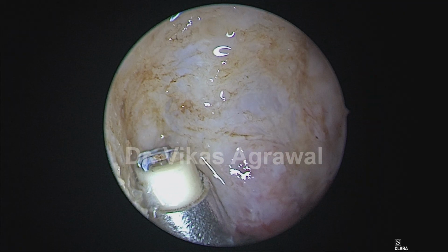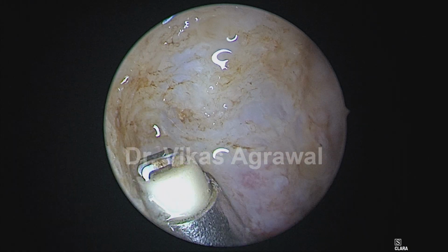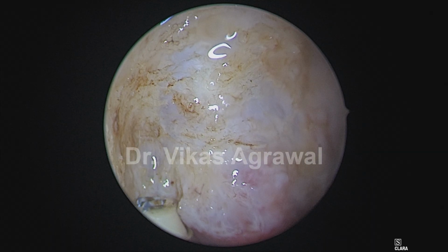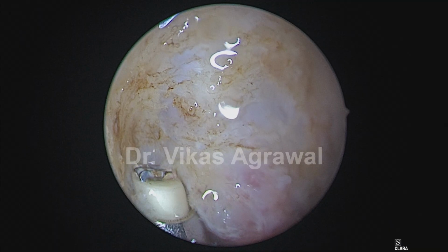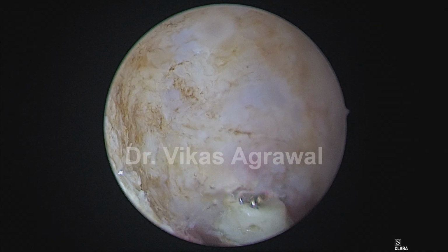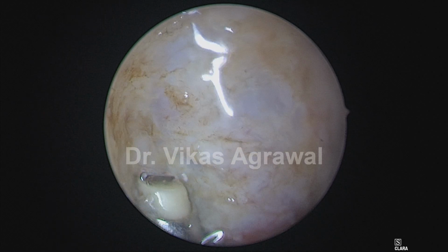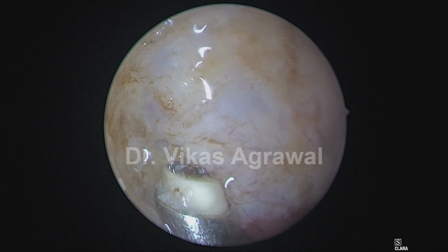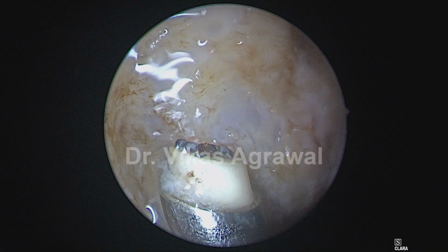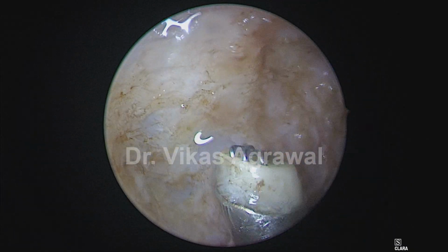Make sure that you are not seeing any pulsating vessel, which is the aberrant carotid artery or a branch of it, and do not direct your wand laterally. So direct the wand medially so that you see the tip of your wand. Now see how much tissue was still there. Alright, so this is the buccopharyngeal fascia which you see on the posterior boundary very clearly.